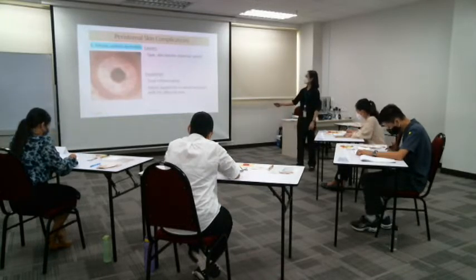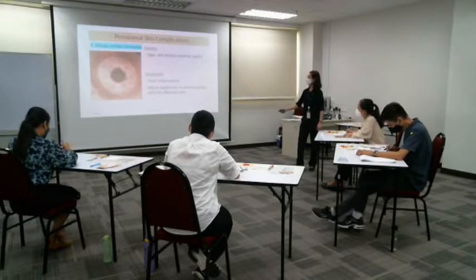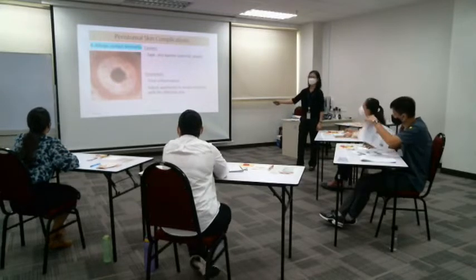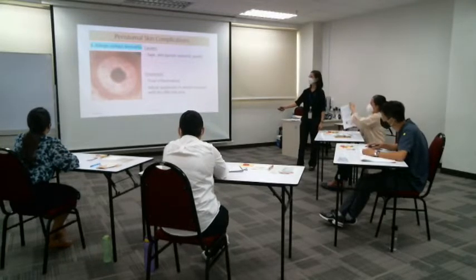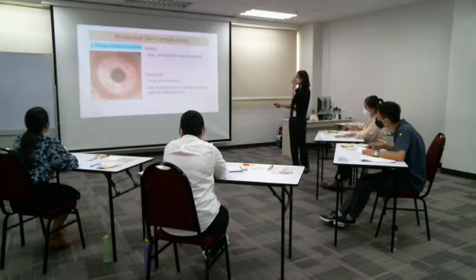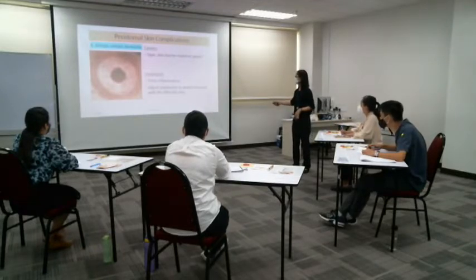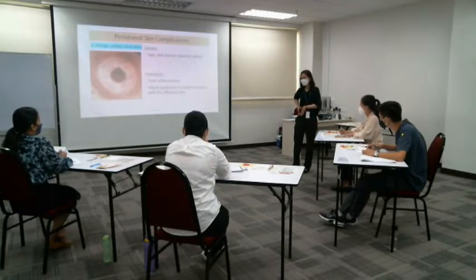Okay, allergic contact dermatitis. This is the stoma. You can see the shape. Right? So it is caused by allergy to tape. It is caused by skin barrier material that you put on, or it can be caused by the pouch, especially a pouch that is closely attached and deeply pressed on it for some time. So you call that contact dermatitis.